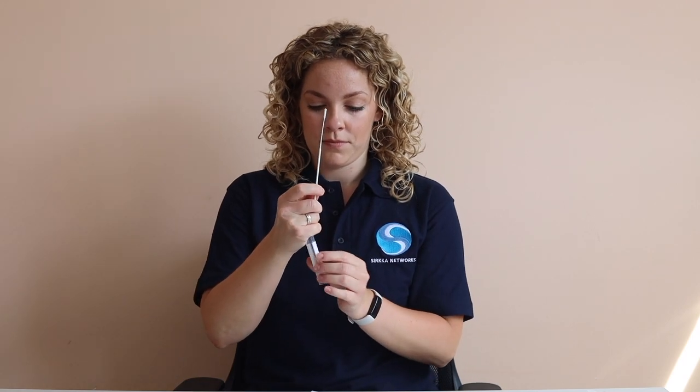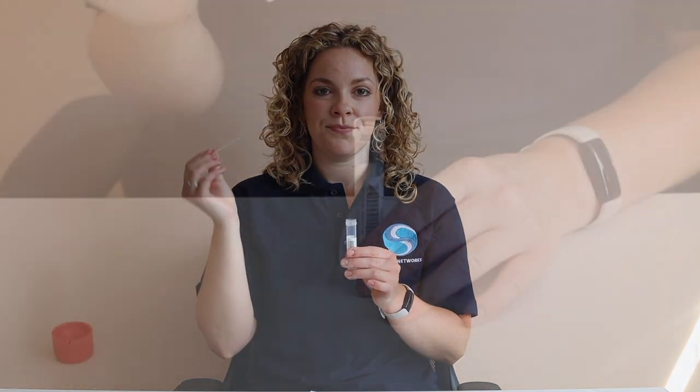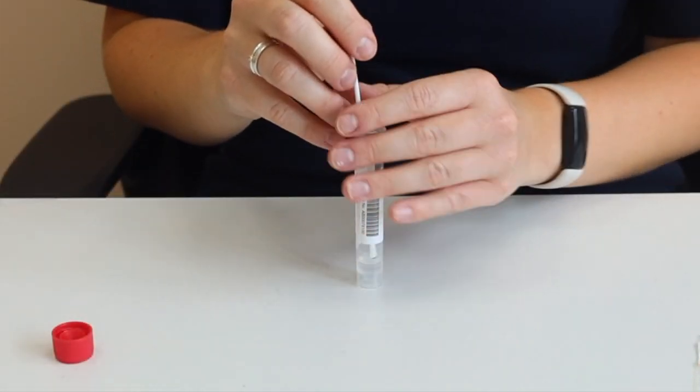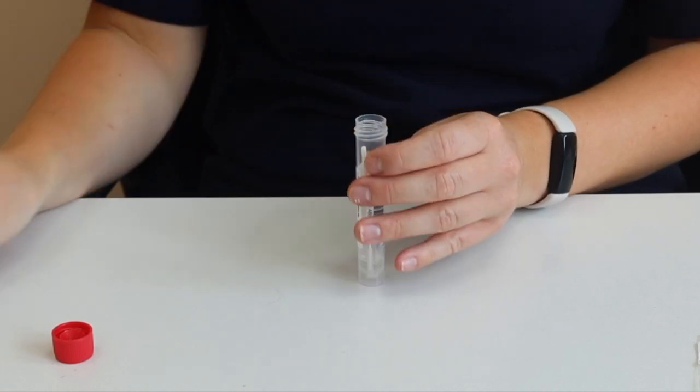Open the tube containing the liquid, being very careful not to spill any of the liquid in the process. Place the swab, fabric end first, into the tube and snap the swab stick at the break point.